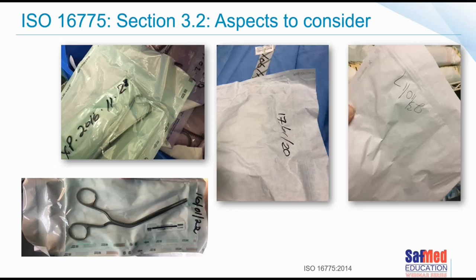We don't want to write within the sterile area. And of course, importantly, we do not want to write with a ballpoint pen because that can damage the packaging. So try writing on the plastic side outside of the sterilization area. Most of us use ink pens from wherever, and we don't know what they contain, and we don't want that material inside and on our instruments and ultimately in our patients' abdomens.